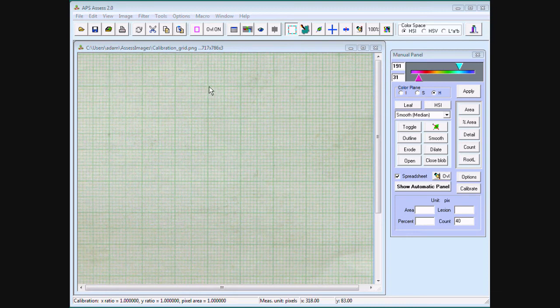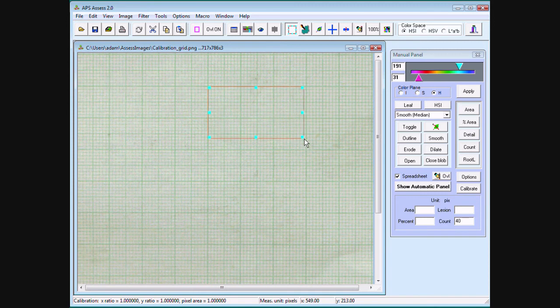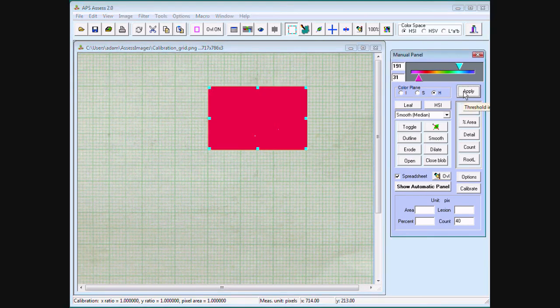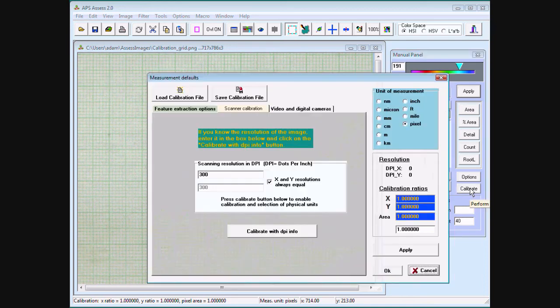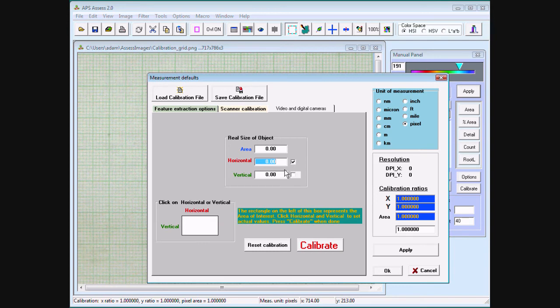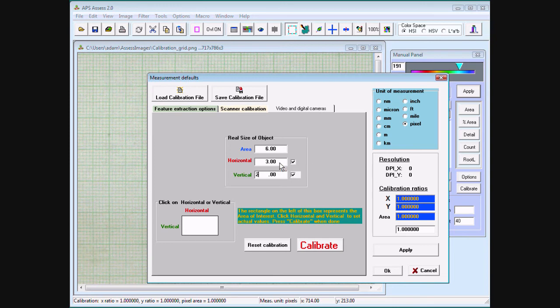Mark the known area. Click on calibrate and click the tab video and digital cameras. In this example, mark 3 by 2 centimeters.